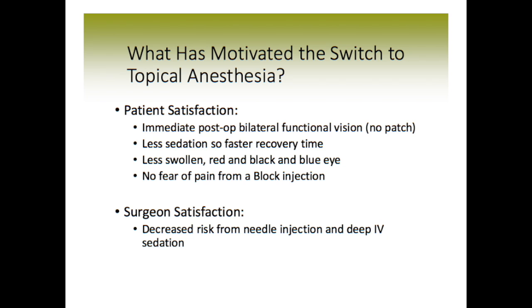Now also, you're going to have less swelling and redness, and no black and blue marks on the eyelids with the topical anesthesia.